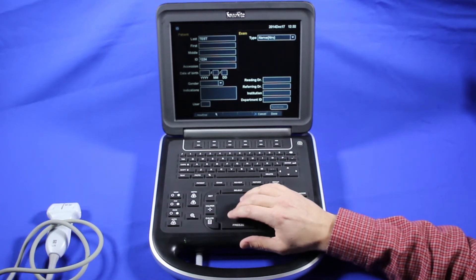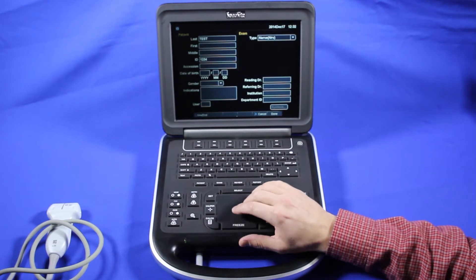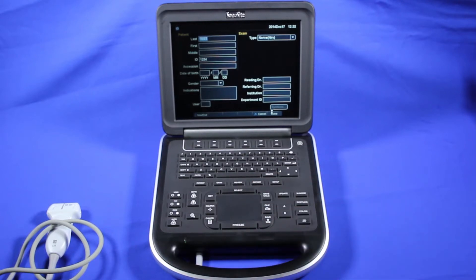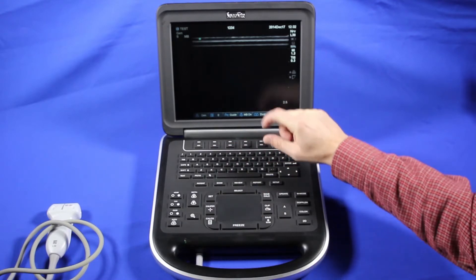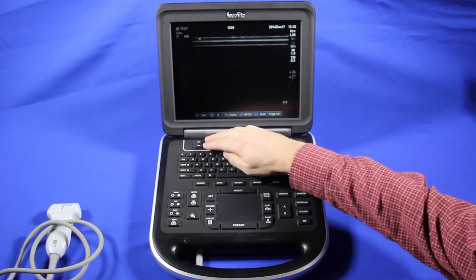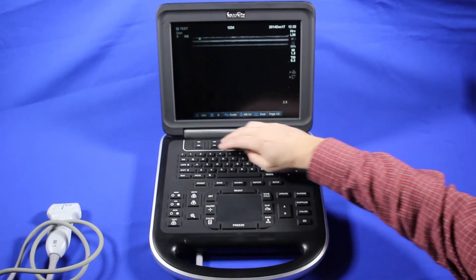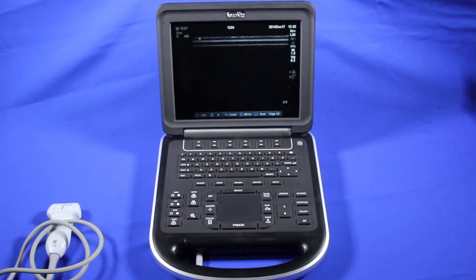Add any other information you might need. Here is where you would end an exam or start a new exam, or cancel it. We'll click done so we can get started with the exam. Now we'll go into a little more depth about some of these controls down here. GEN is for general imaging, and this would be like selecting a frequency range on another transducer.